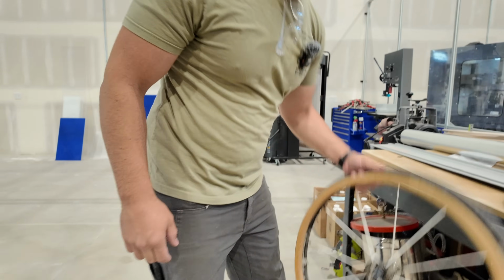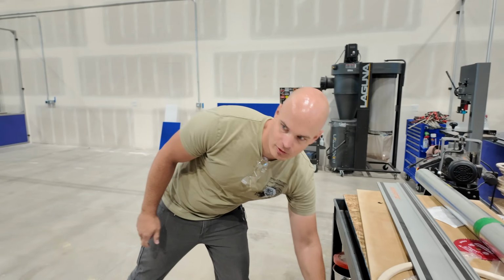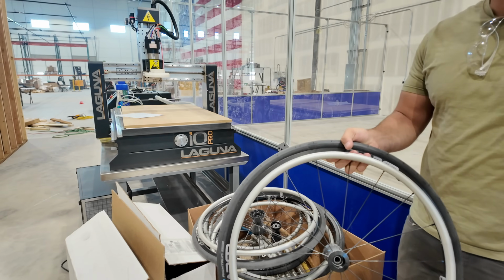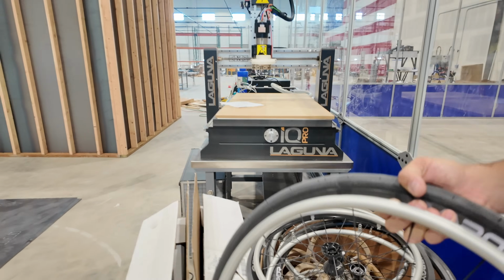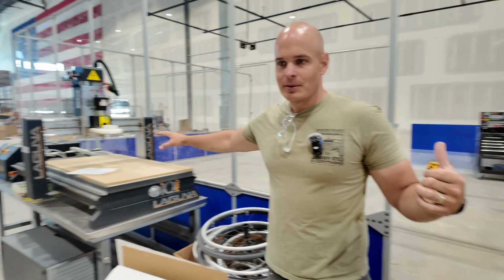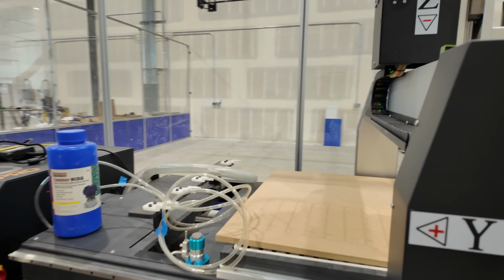So this is one of our early prototypes, but this hand rim is made out of wood. If you think about it, a metal hand rim, which I think I have one over here, in the winter or the summer, they get super cold or super hot. Wood doesn't get as extreme temperature changes. Because in the winter, if you're pushing with the metal hand rim, your hands get really cold really quick. That's why we built the wood ones, and we have this machine right here, which is able to mill those out pretty quickly. Again, for super cheap, because wood is a fairly inexpensive material.